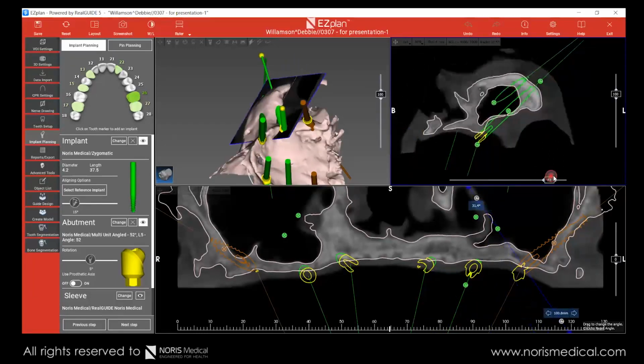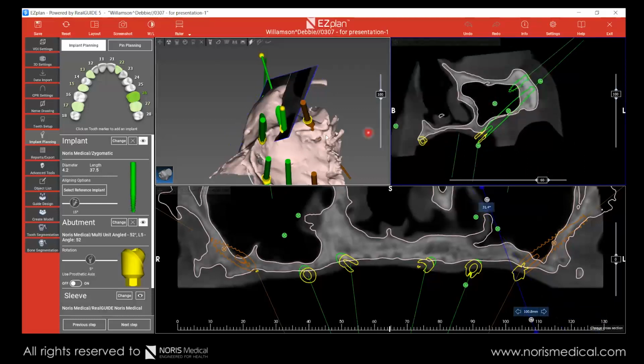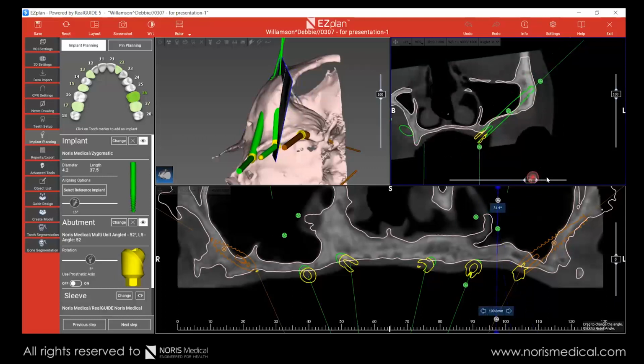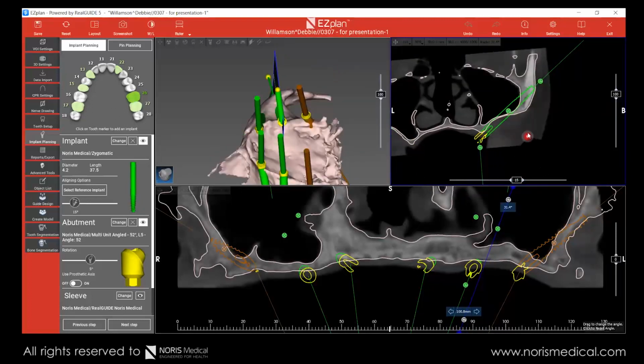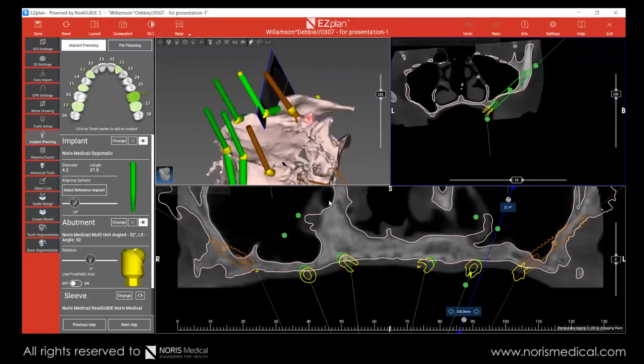You see, we are far away from the implant, we are not colliding with it, even though we are almost crossing. Okay, we do have, however, on this angle, the angle of the multi-unit, very small support from the ridge. Okay, let's look at the other side.